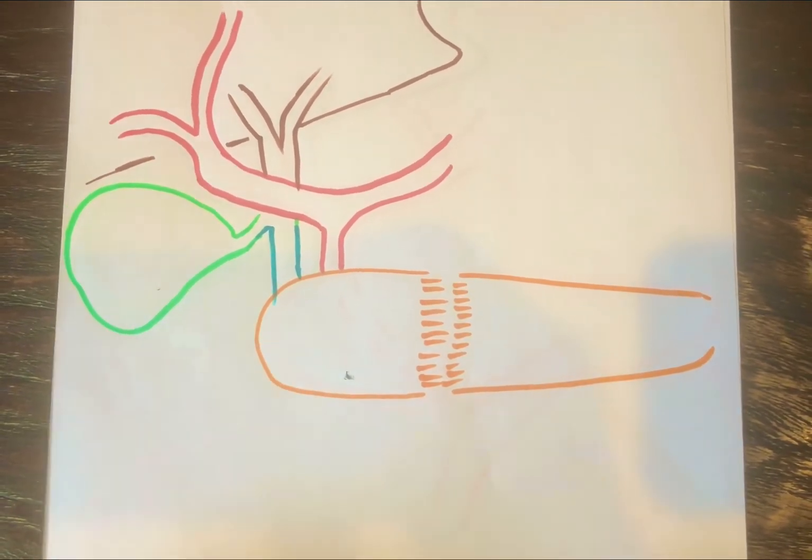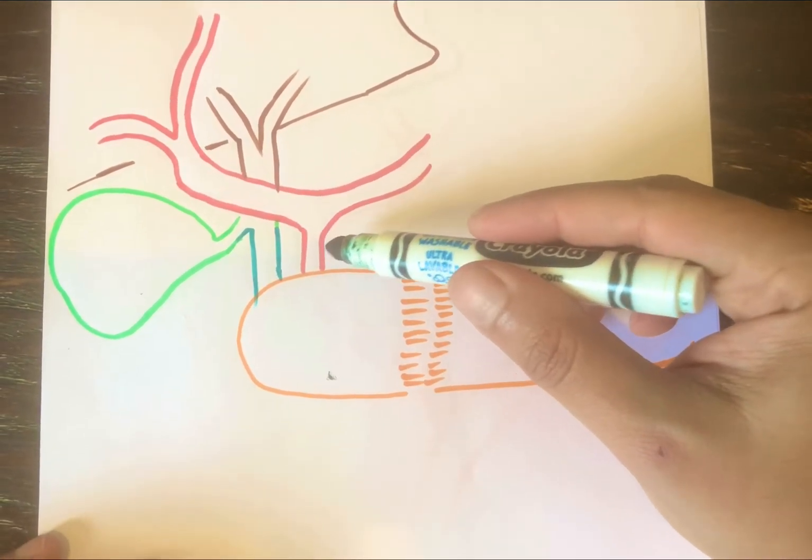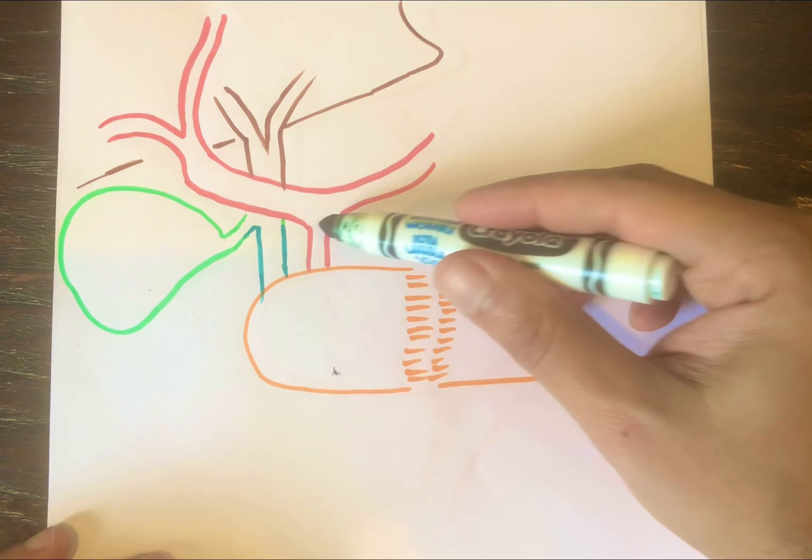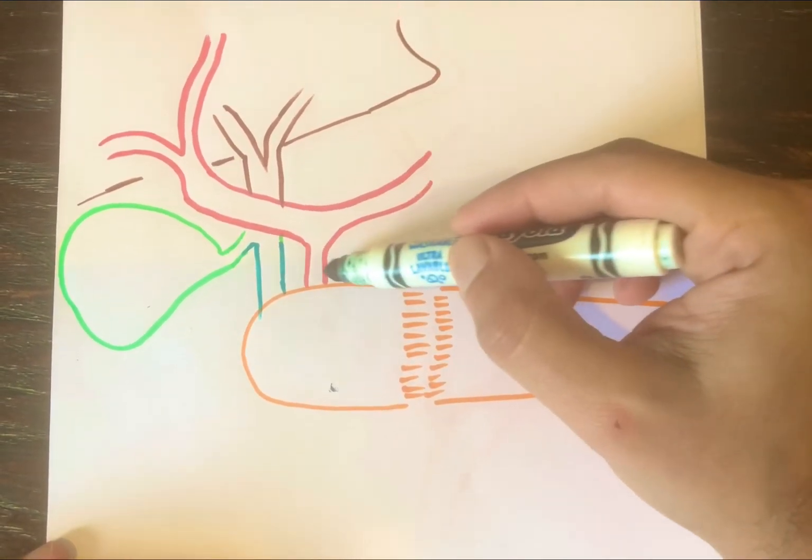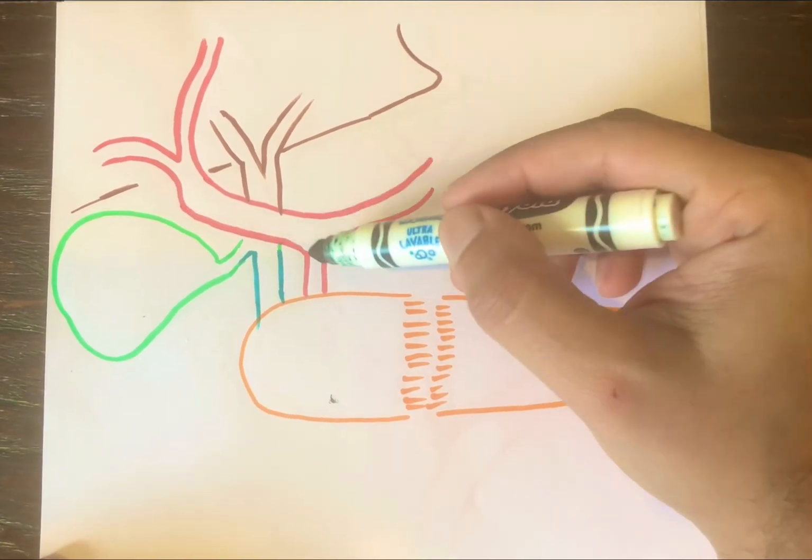Sometimes when you're dissecting more up, then what you do is you just dissect a little bit lower and you'll be fine. You don't have a signal here, you don't have a pulse here, but as you dissect it more down, now the return of pulse and blood flow is there. So you're good to go.